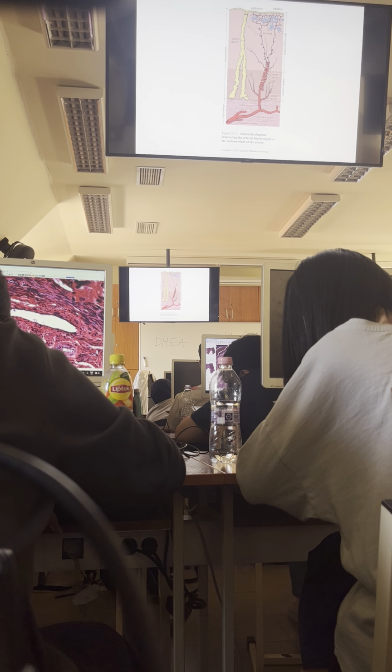So the tissue starts to degenerate, but only the functional layer starts to degenerate. The basal layer won't, because here in the basal layer we have the straight part of the artery which is not hormone sensitive, so it is not contracting. So blood can flow up to this point, can supply the basal layer with nutrients and oxygen. So those cells live further happily, unlike the cells of the functional layer.